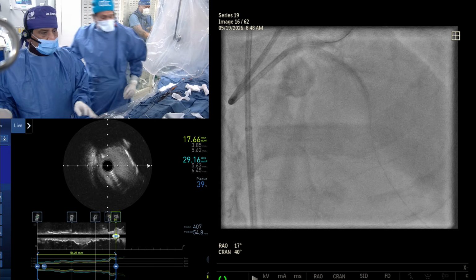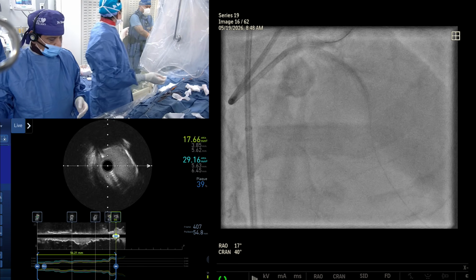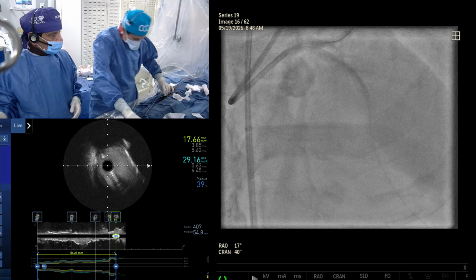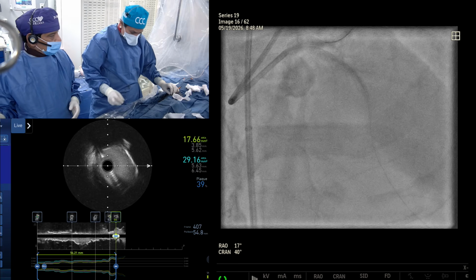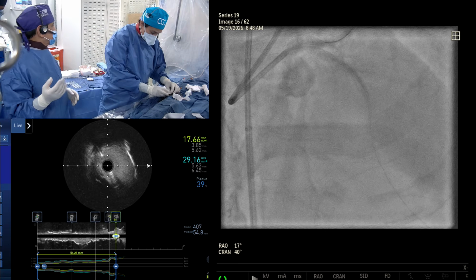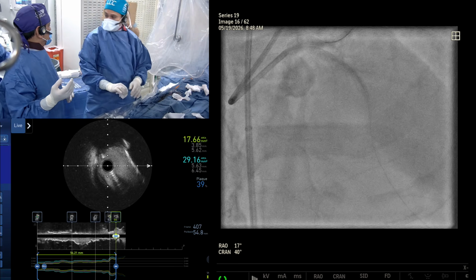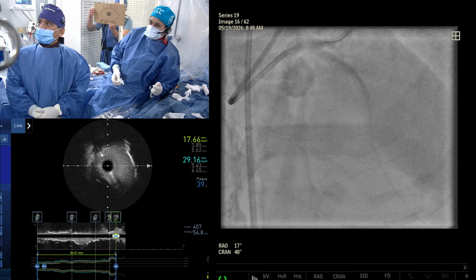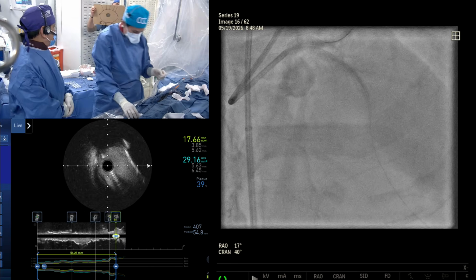Nothing wrong. I remember that, I go with the eyes. Bring here, show. IVUS, please. Look at what Will has there. He always has it. Where is he? Can you see it? Show the, yeah. Focus on the IVUS camera.